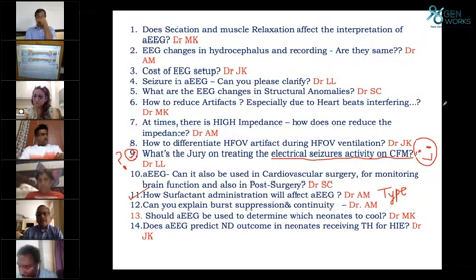In babies with injury, for example severe hypoxic injury, or in preterm babies, you have a discontinuous or a burst suppression pattern where the interburst interval is much longer. And if you look at the quiet period between bursts in burst suppression, there's almost zero voltage activity, so your baseline is completely flat, and then you get a burst. Whereas in discontinuous, you will have some baseline activity. So on the aEEG trace, your lower margin in burst suppression is almost a straight line, whereas in a discontinuous trace you can actually see some low voltage variability.